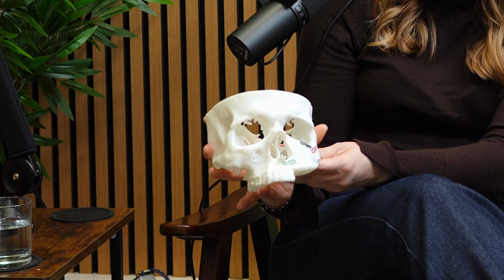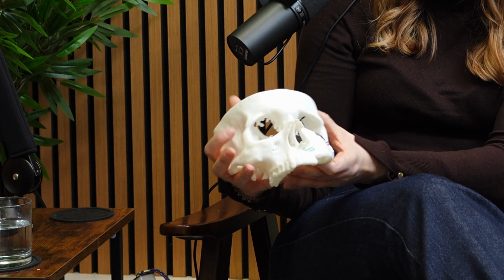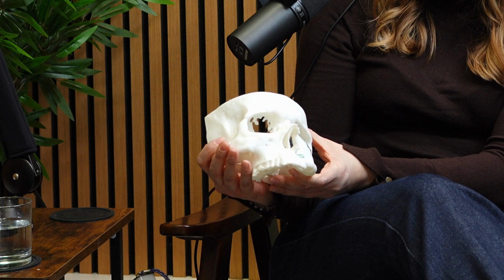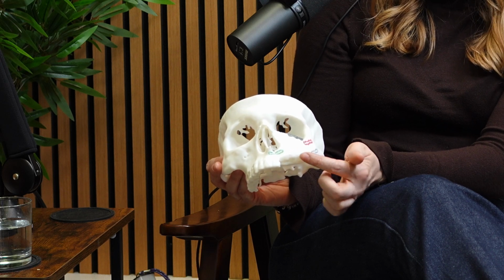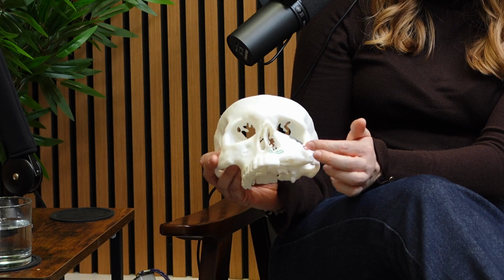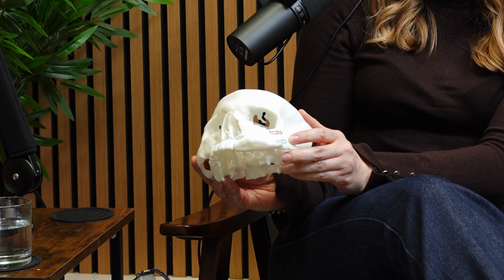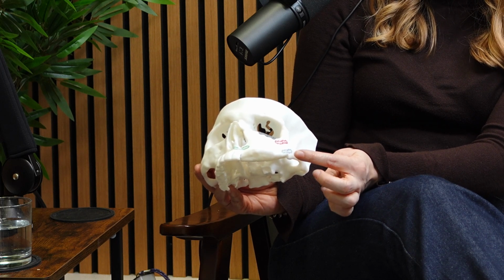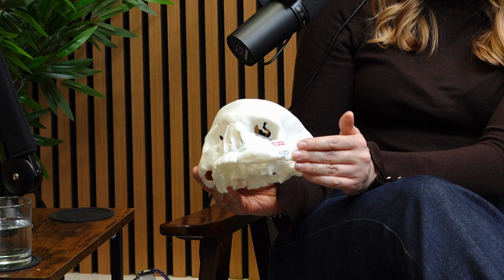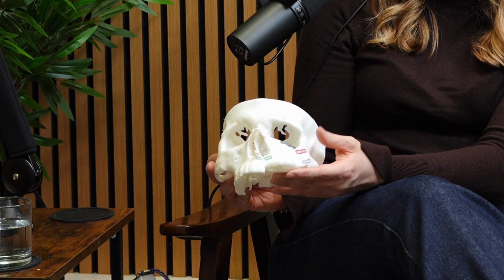Okay, and we've got a few models here that you've brought in today? So this is the model that was obviously involved in the case study. Here's your maxilla area. This is what it would look like when there is no problem, and this is the reconstructed side. This is showing the pelvic bone in place that's then been shaped for the orbit and the nasal area, and the colours are for the different plates that would have been bent to hold this new reconstruction in place. They're called mini plates, so they're just drilled into the bone and onto the part of the maxilla that's still there. And then this plate is an orbital floor plate that's been made in the lab.